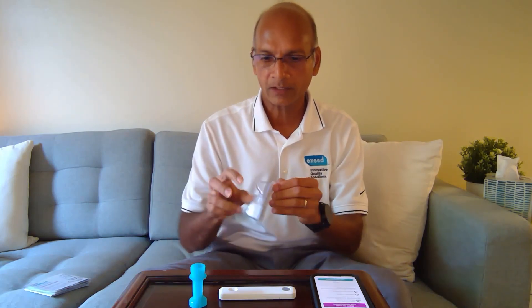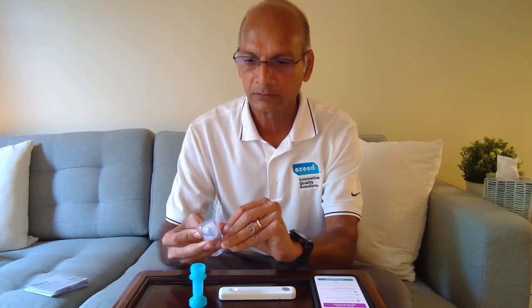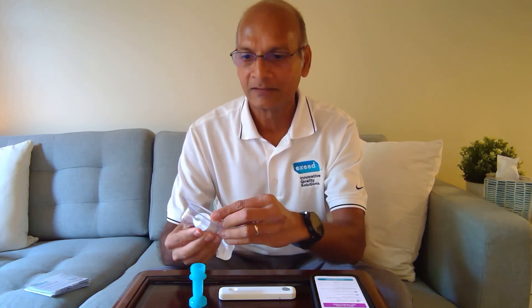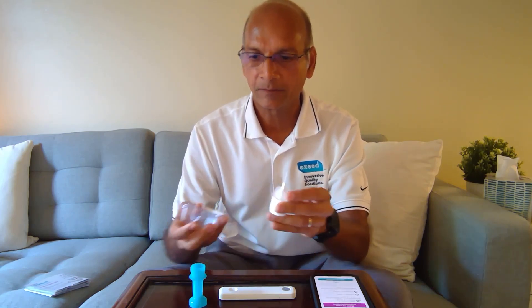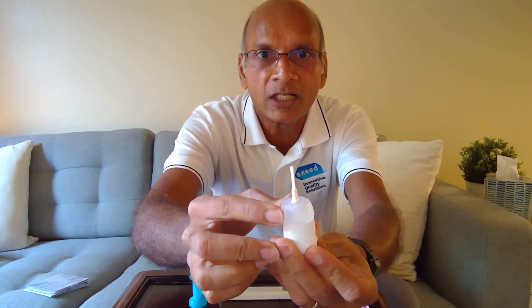Here is the swab. Do not touch the tip of the swab. We're going to take this out slowly — do not let it fall on the floor. The portion at the top is the child adapter: if you're using it on a child, this stays put because it just shortens the length. But you can pull it out — it pulls out very easily. So we are ready.